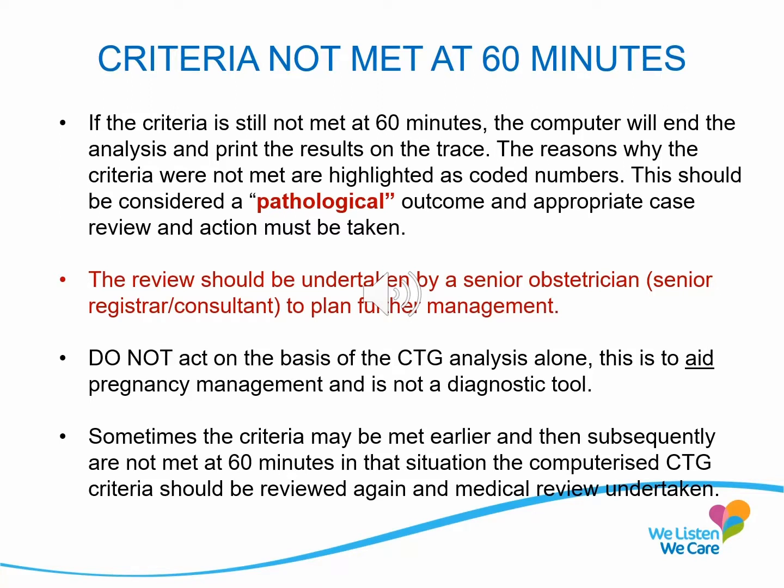This should be considered a pathological outcome. An appropriate case review and action must be taken. This review should be undertaken by a senior obstetrician, a senior registrar, or a consultant to plan further management. Do not act on the basis of CTG alone because this is to aid pregnancy management and is not a diagnostic tool.